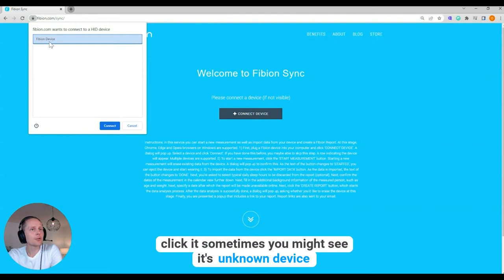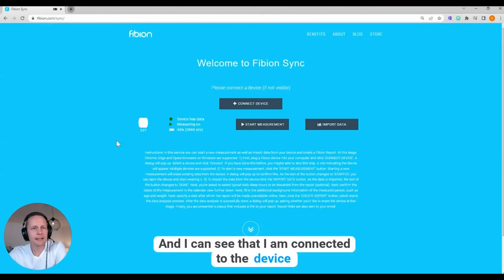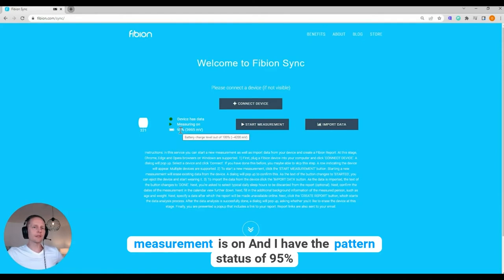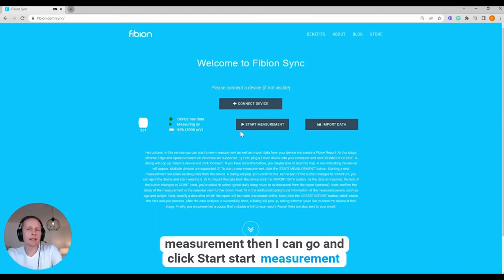I click it — sometimes you might see it listed as an unknown device, but just click that one. I click 'Connect' and I can see that I'm connected to device number 321. The device has data, measurement is on, and I have a battery status of 95%, which is about one month of measurement.